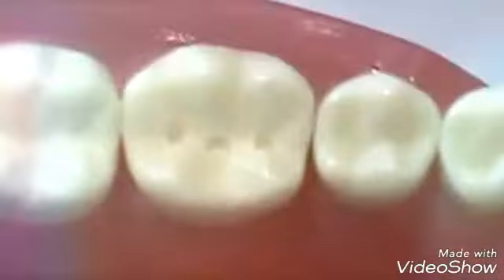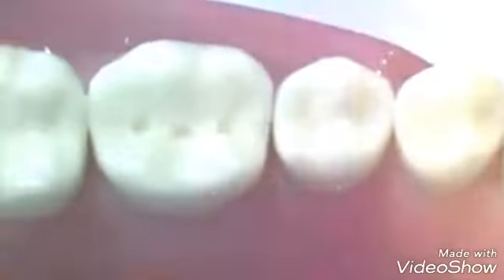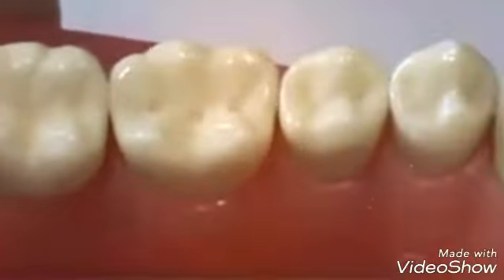And now we check the depth of all 3 holes. Now we have to remove the tooth structure between the holes.